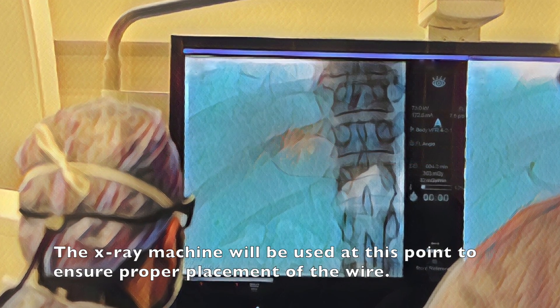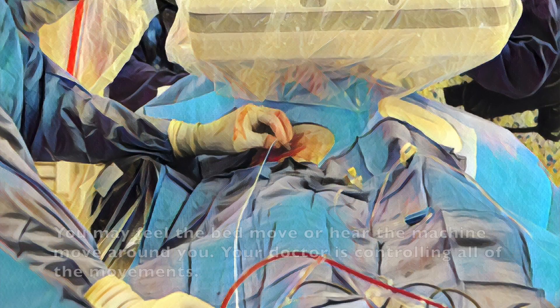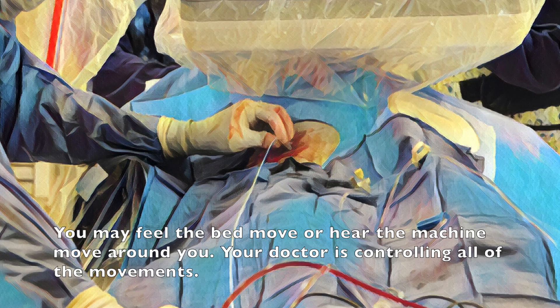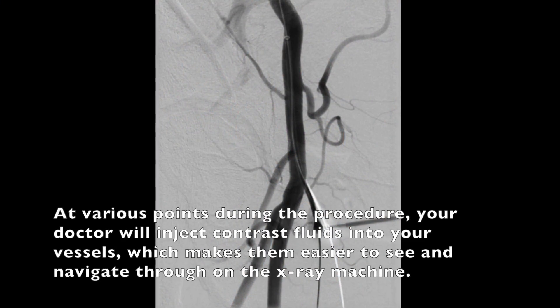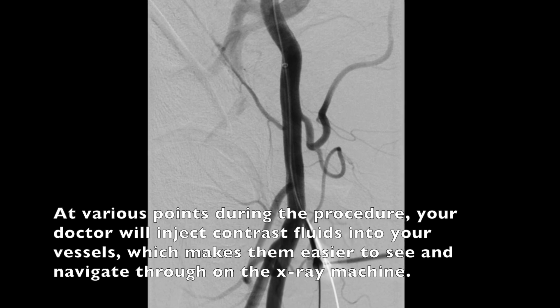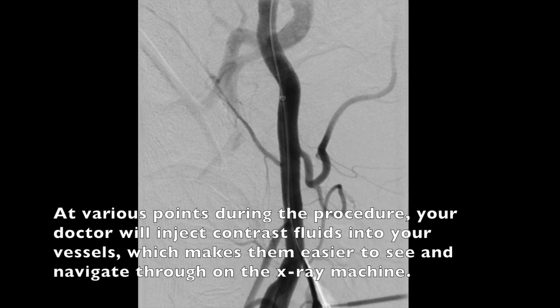The x-ray machine will be used at this point to ensure proper placement of the wire. You may feel the bed move or hear the machine move around you. Your doctor is controlling all the movements. At various points during the procedure your doctor will inject contrast fluids into your vessels which makes them easier to see and navigate through on the x-ray machine.